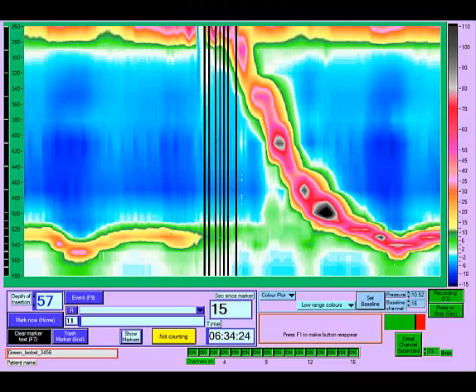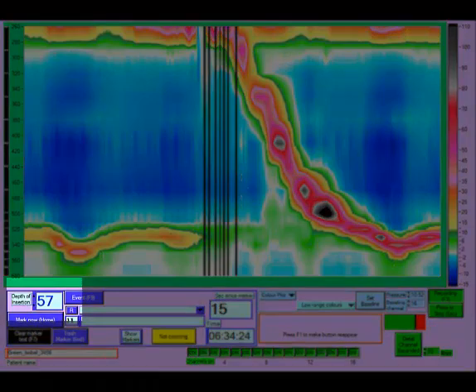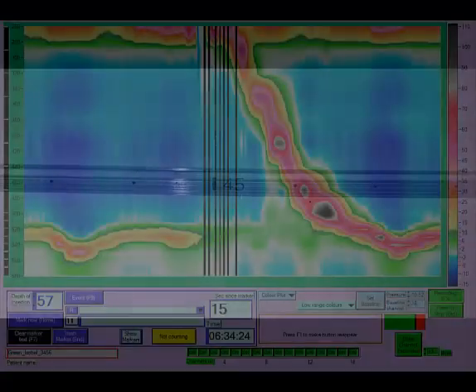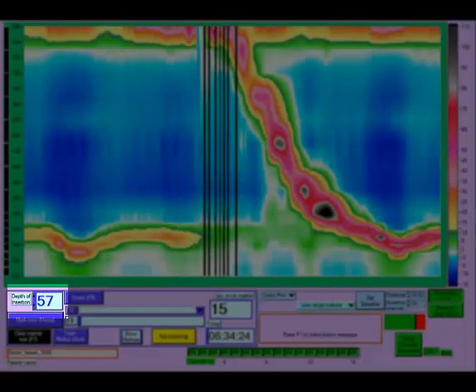Once the catheter is correctly positioned, you need to adjust the depth of insertion control on the screen in order to ensure that the scale along the left-hand side represents the distance from the nose. The depth of insertion can be read from the markings on the catheter, and the depth of insertion control on the left-hand side of the screen is then adjusted to correspond to the number read from the catheter, which represents the distance from that point to the most distal recording point on the catheter.